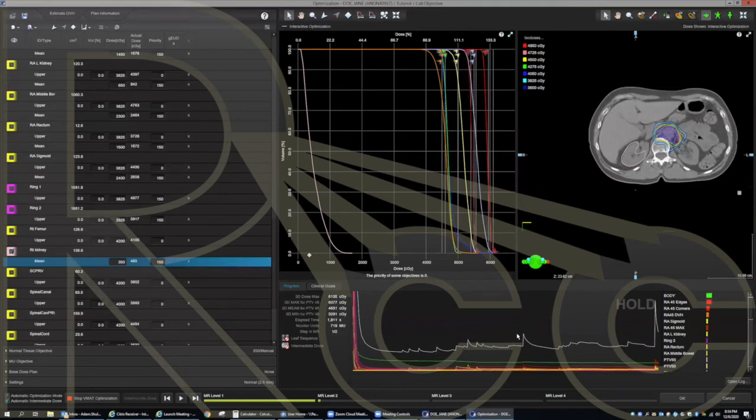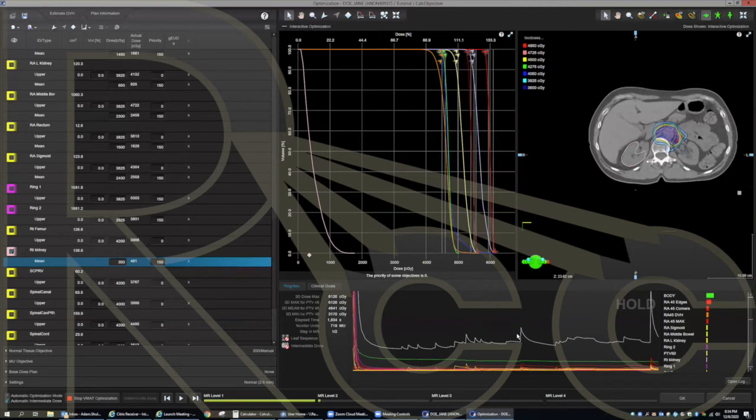So for things like head and neck, if I'm doing, say, nasopharynx with optics involvement, optics take priority. So maybe I'll have, say, a PTV 59.4 going into the optics. Well, I would cut out PTV 59.4, say 3 millimeters away from the optics, which I want a max dose of 54 gray. And then I would limit my PRVs to 60 gray.